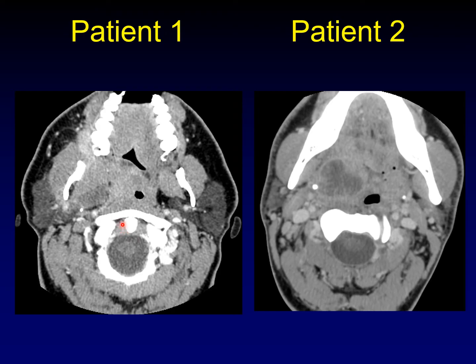In patient 1, we're going to use the parapharyngeal fat to help us decide where this cystic lesion came from. We talk about displacement of the parapharyngeal fat helping us to decide the origin of lesions in this location. But here, the parapharyngeal fat has not been displaced. There is parapharyngeal fat all the way around the outside of the lesion.